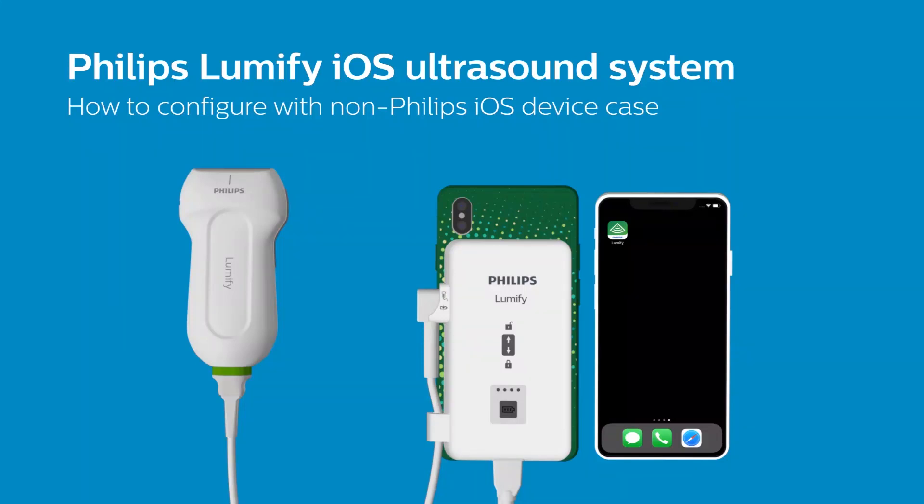In this video, we will cover how to configure your Lumify iOS ultrasound system for live scanning while using a third-party device case not included with your purchase.